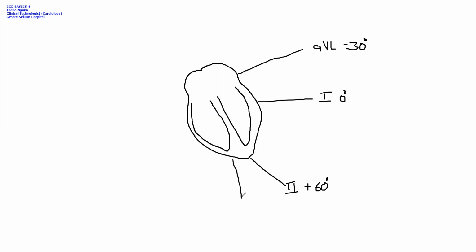Then we have our AVF at plus 90, with lead 3 at 120. It's plus or minus?